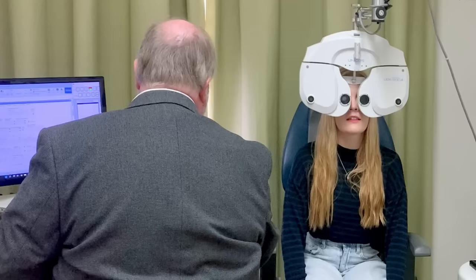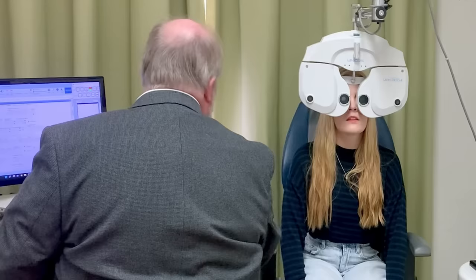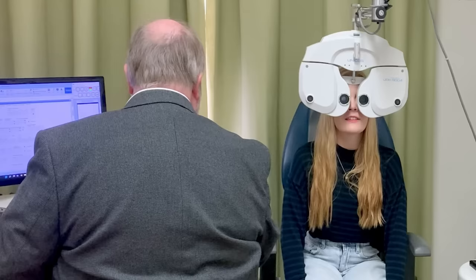They're not much in it. First again. Second one. Oh wait, yeah, the first, I think. And we'll try that once more. Any better for the first lens or the second one? Maybe the second, actually. Second the better? Yeah. And again, any better with that first one? Or the second one? I honestly can't tell. They're very similar, are they? Not much in those two. Okay, that's good. Let's go back to that.